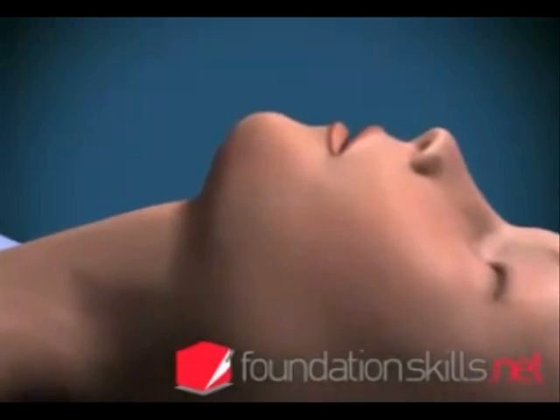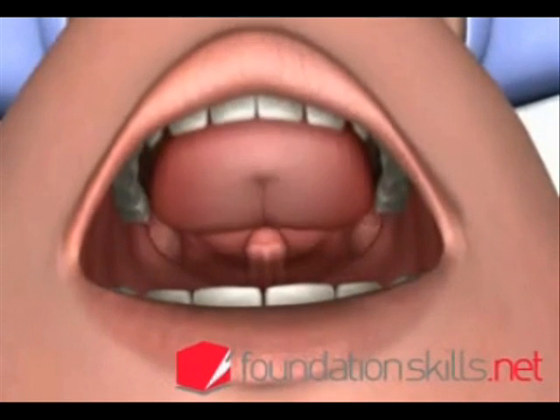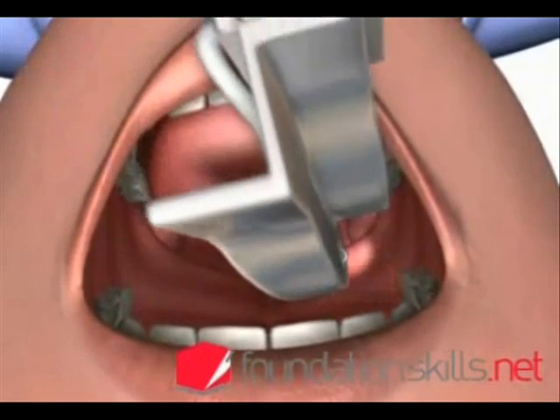Standing behind the patient with the head in the sniffing the morning air position, with the left hand insert the curved blade of the laryngoscope into the mouth over the right side of the tongue, displacing it to the left and upwards.